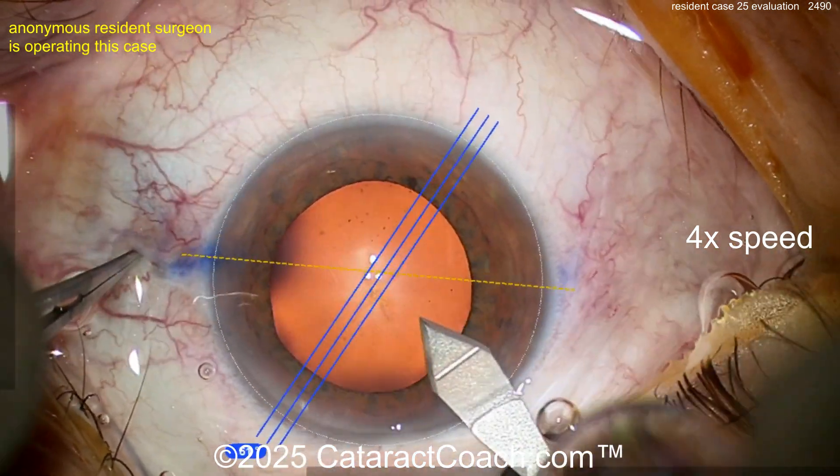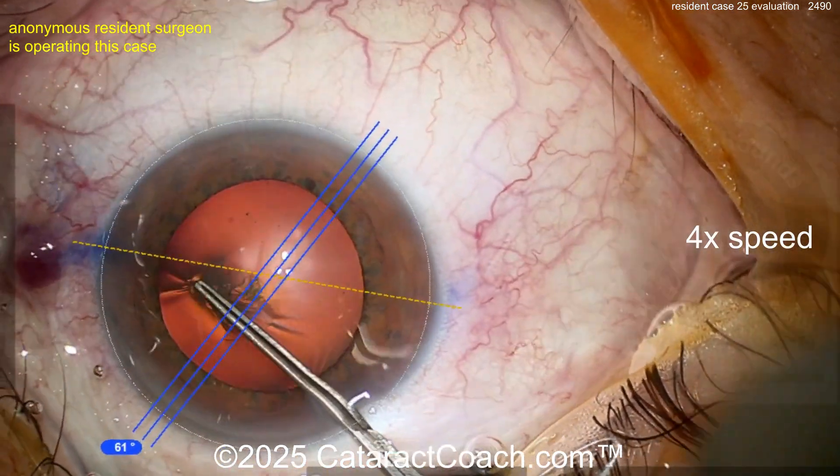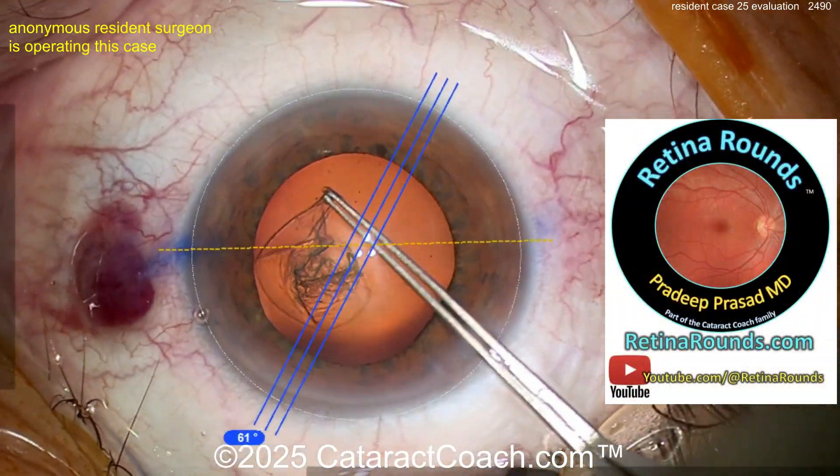The incision looks okay, a little short maybe. Oh, look at the bleeding — you grabbed the conjunctiva with the forceps and you've got some subconjunctival hemorrhage.